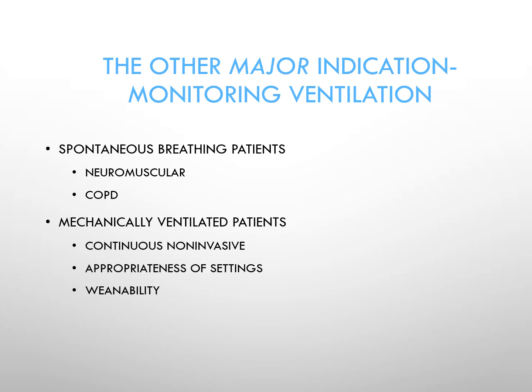Whether it be spontaneous breathing patients, who, for example, are neuromuscular patients coming in for their regular checkup, or COPD patients, who don't have a neuromuscular disorder but are prone to retain CO2.